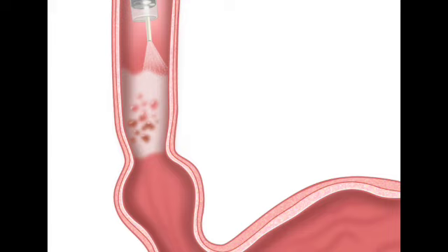And just like in the esophagus, it can be incredibly hard to see exactly where the healthy stomach tissue ends and this abnormal metaplasia begins. Because the tissue looks too similar. Exactly. But when the acid spray is applied, the differing cellular structures react differently, and it clearly defines the boundaries.